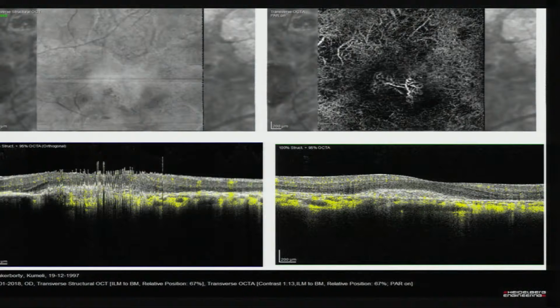We have a series coming up in the Retina Journal where we have said that if the patient is symptomatic and you are suspecting there could be an underlying neovascular membrane, and amidst all this hullabaloo of scarring or a bad fundus, you are not able to pick it up, you cannot rule out CNV unless you have done OCT angio. So I hope that answers. Yes, Vishika.